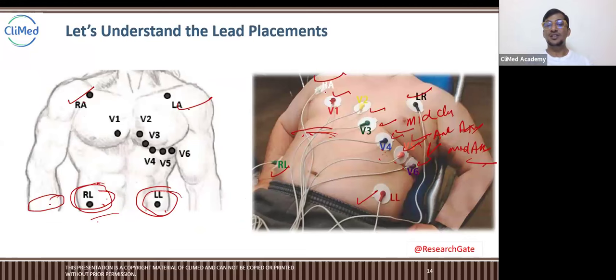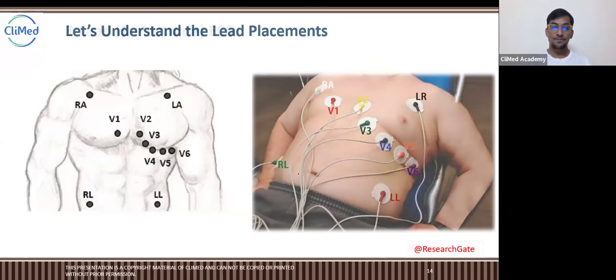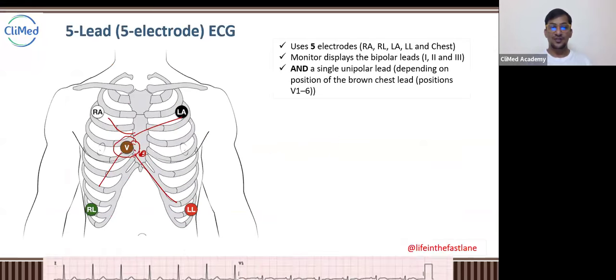See, it is not put on arms. This is not on arms. As I told you, this is on the shoulders. This is near to the shoulders. Here, look at this. These are not the legs. These are on the stomach only, just at the starting point of thighs. Okay, this is a very simple answer to your question.